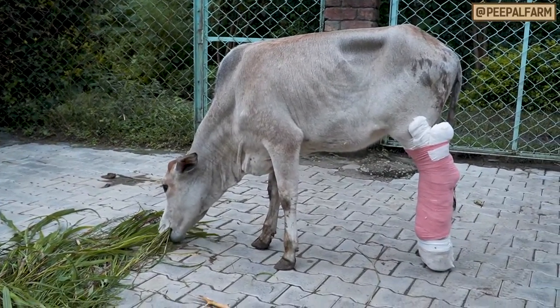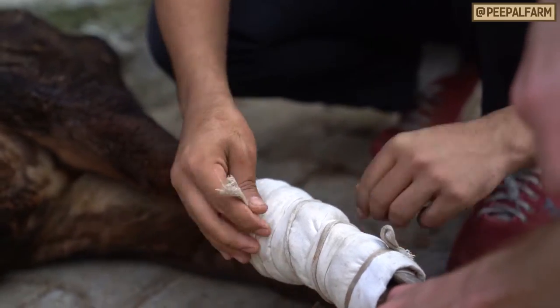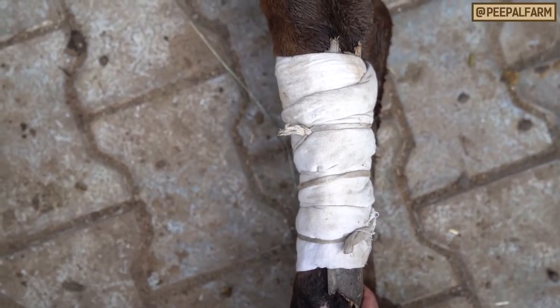Now you're ready to transport the animal to the vet. If you get caught unprepared and you don't have gauze and cotton, you can use cloth to cushion the splints and the leg, and ropes to hold the splints in place until you can replace them with gauze and cotton.